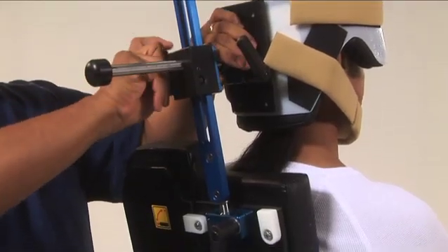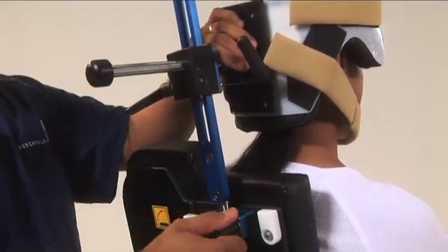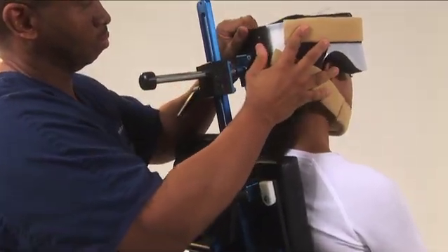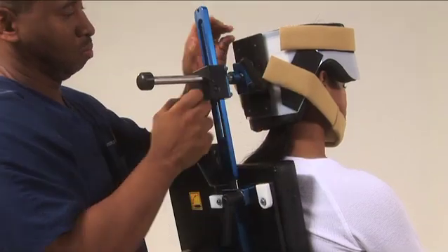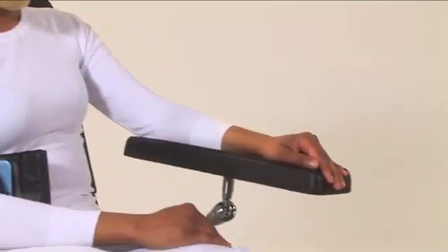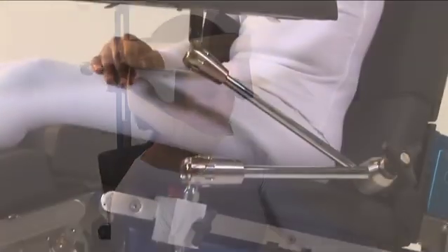To position the patient, start with the head system locked in the straight flat position. Leave the slide locking knob in the loose position so that when the chair is raised or lowered, the head section will slide. Remove the head and chin straps and place the patient on the table.